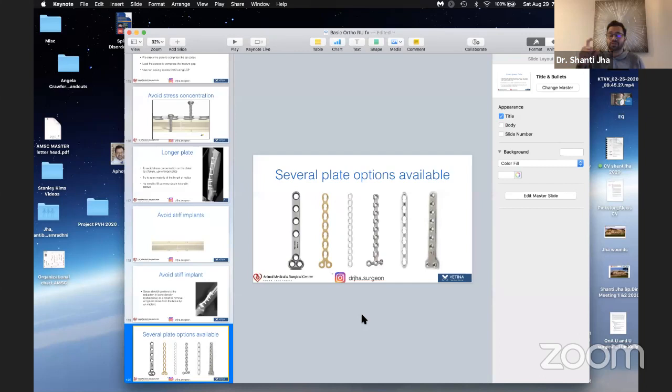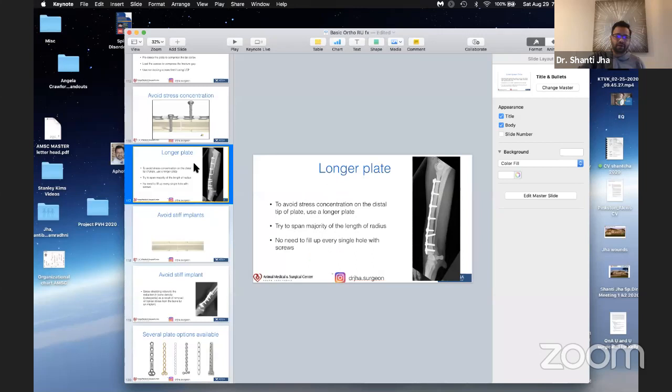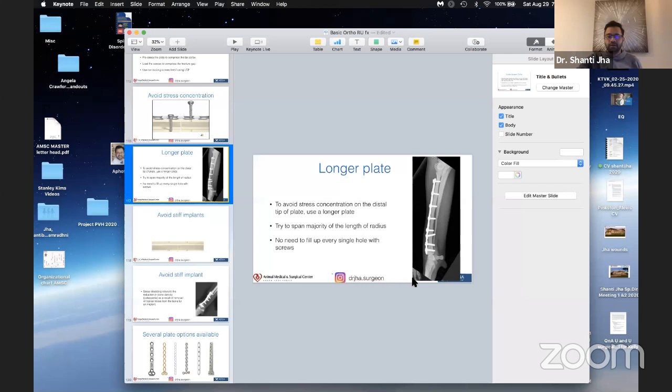But to answer your question, it's 75% of what I choose that the bone should be, in radius ulna or even in many other bones that I span if I'm doing the open fracture reduction technique. So the answer is 75% of the bone length. For example, right here on this, you can see it's a longer plate being put. I hope that answered.